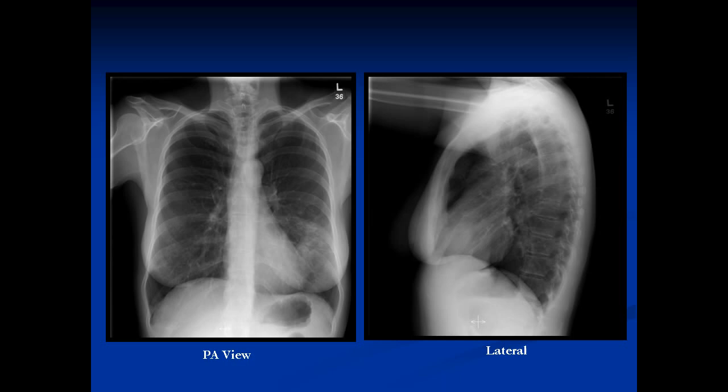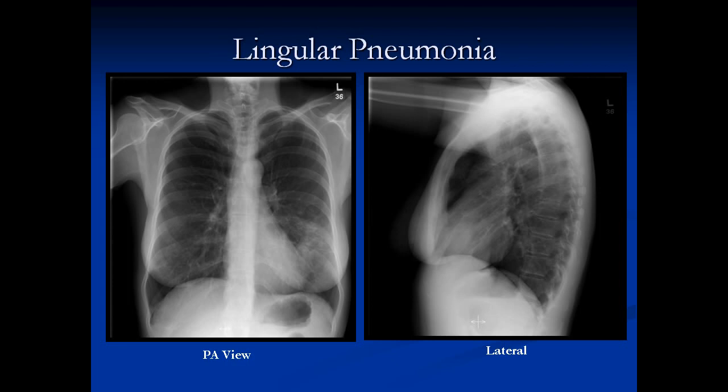What border is missing here? We can see the right atrial border, right diaphragm, and most of the left diaphragm, but we've lost the left heart border. There's an area of consolidation there. On the lateral film, looking at the heart, there's an area of increased soft tissue density — this is a lingular pneumonia. You can see this white area right there.